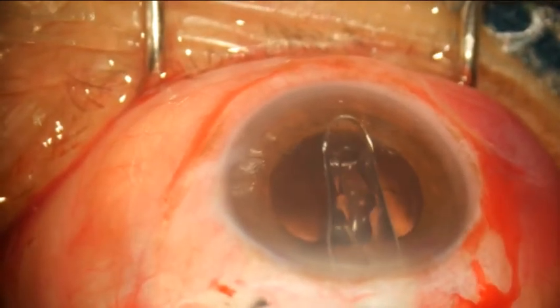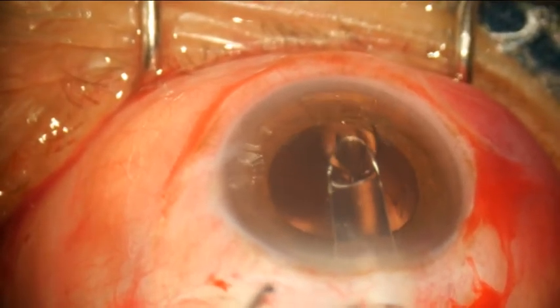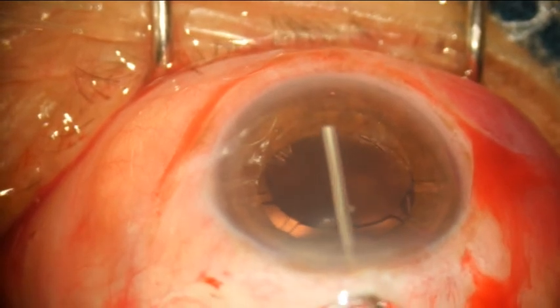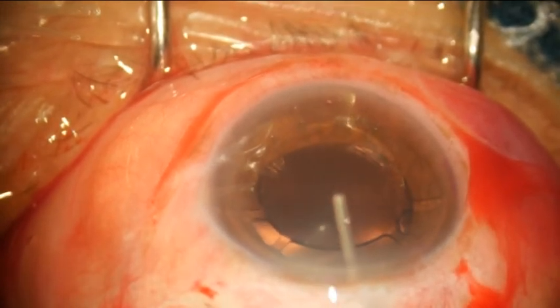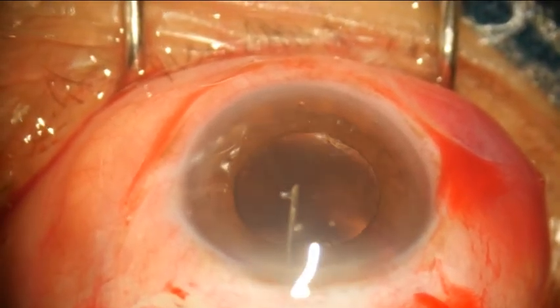This is the Zeiss 3-leg IOL being inserted. It is placed onto the iris first, then visco is applied on top of the IOL, and the legs are then gently nudged into place inside the capsular bag.